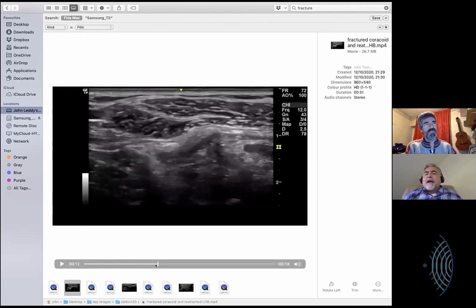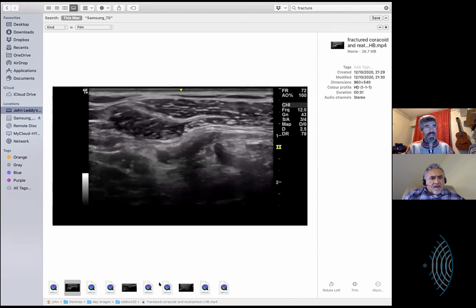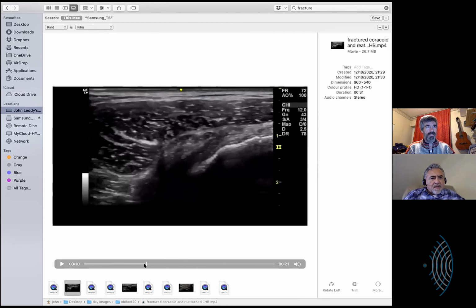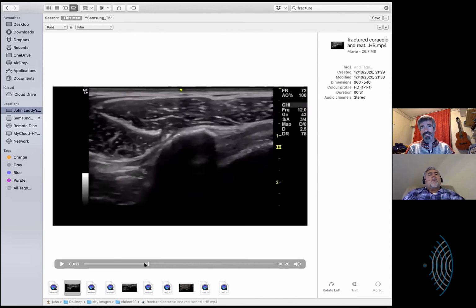As I scanned down, it looked wrong because you were not expecting the bone echo to be in that location. The first thing I thought was some sort of weird calcific deposit, angulation, or literally it crossed my mind that it could be some sort of avulsion, but it was just the wrong shape. So I just scanned up and down it, and it comes to an end like that in one direction, and like that in another. And I suddenly realized that 18 months previously, when they'd fallen down the stairs and not gone to A&E, they'd actually snapped their whole coracoid.